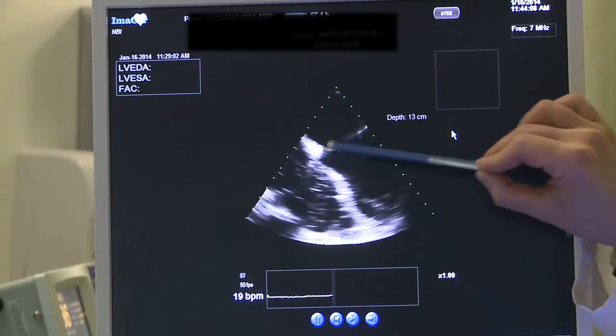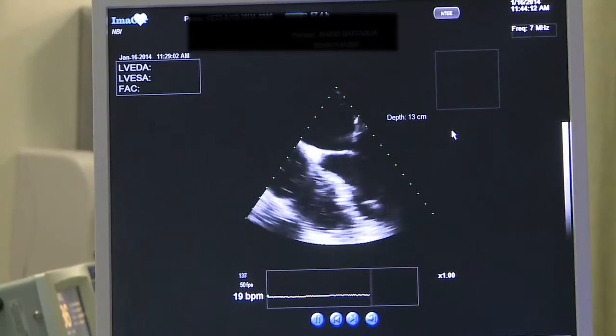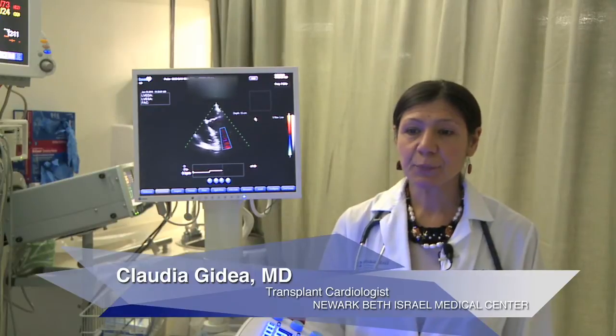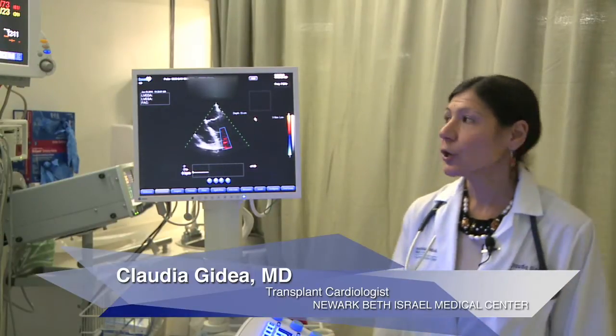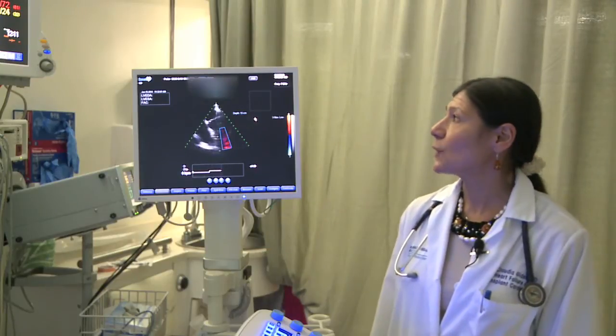We have the mitral valve, interatrial septum, interventricular septum, and tricuspid valve visible. Pump speed increased to 8800, pulse index 6.3, and power 5.2. We have a CVP maintained around 12, and mean arterial pressure increased to 81 from 77.